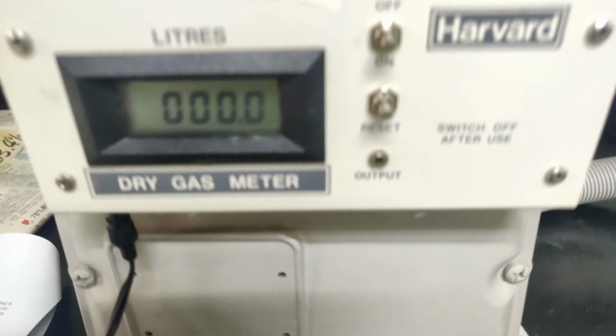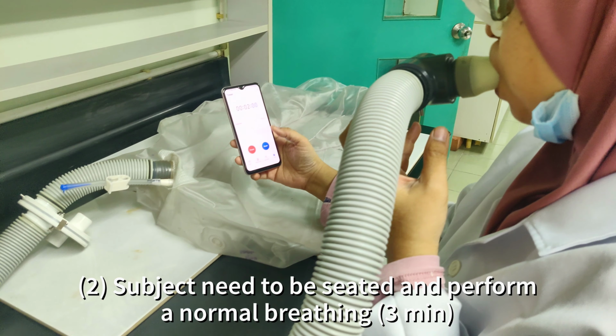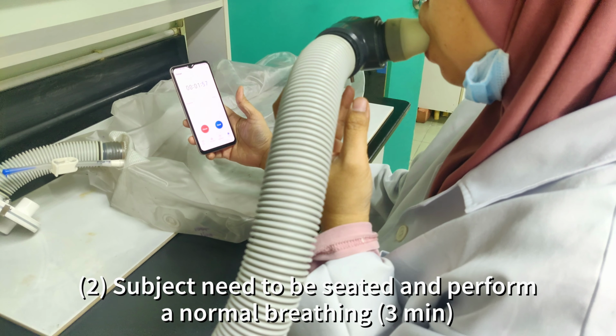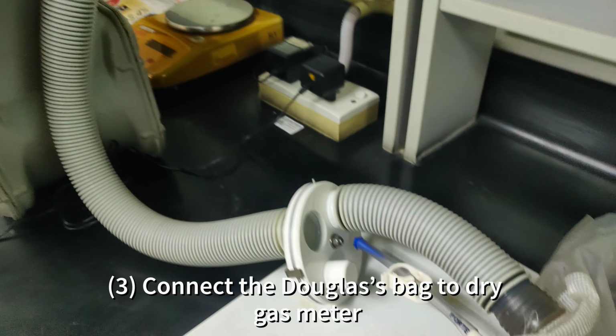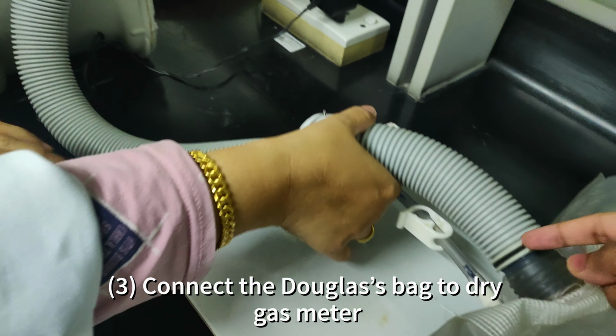When the subject is ready, we're going to ask the subject to breathe normally for 3 minutes. As you can see here, the tube is directly connected to the Douglas bag. After 3 minutes, all the collected air will be transferred directly to the dry gas meter, and you can see the change in the size of the Douglas bag. Then we need to connect the tube directly to the inlet side of the gas meter, just to transfer the gas directly, and make sure that the tube is connected together.